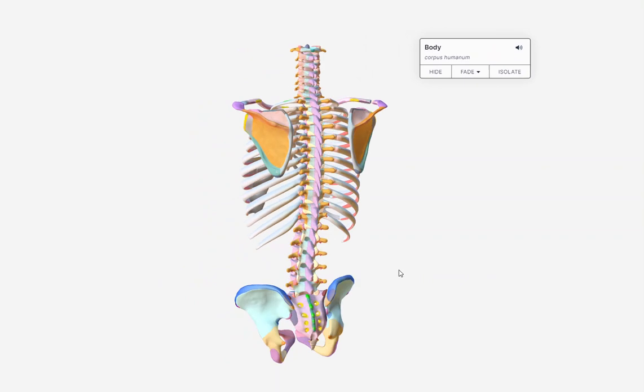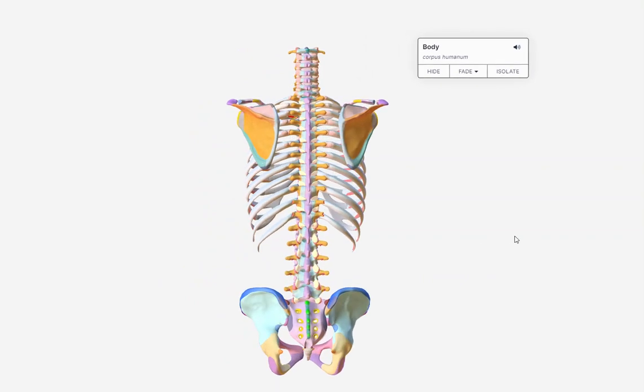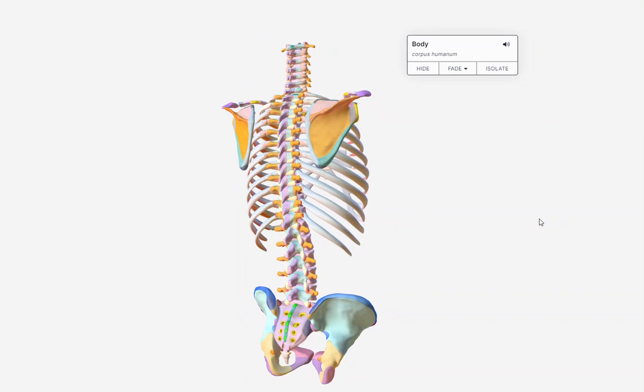I'm going to turn this guy around like this. Do our PA projections, rotating the patient into a left anterior oblique. This is our patient's left side. Left anterior oblique. Left side rotating down towards the IR. Now look what's happening. On a left anterior oblique, the right ribs will be elongated. The right ilium will be elongated.